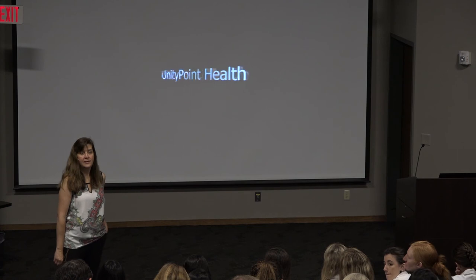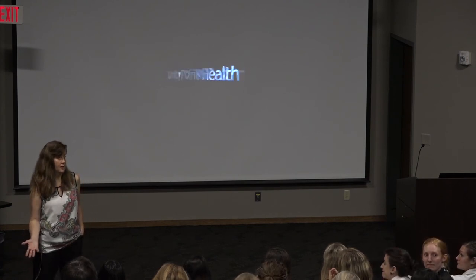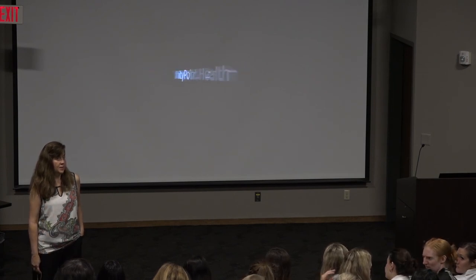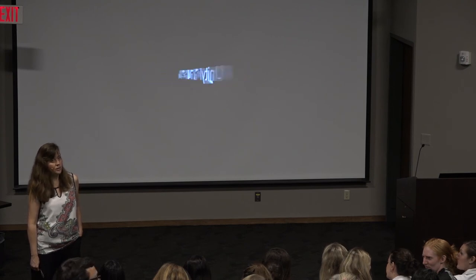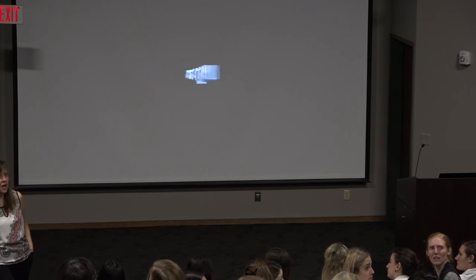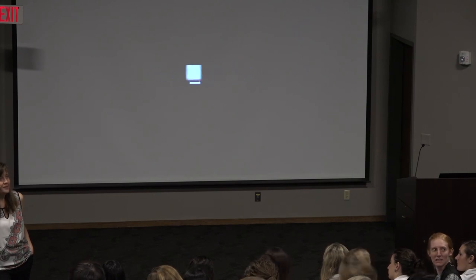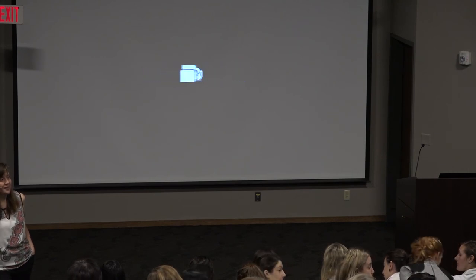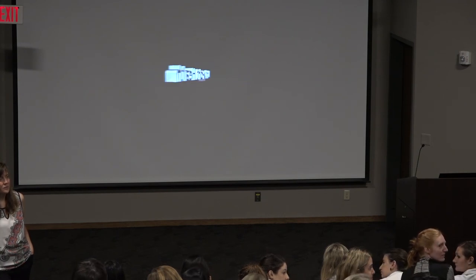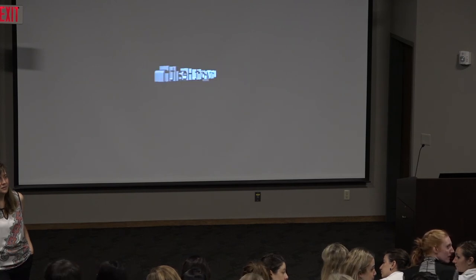So this would be a good candidate for an MR to follow the ultrasound. If you're not sure, getting an MR to follow ultrasound for suspected AVM might be a way to help us clinically. It may be. I don't know. Has it been helpful? Honestly, we just started doing these, so I don't know. I think for the couple that we were concerned enough about, where we didn't want to just sit and wait, and the bleeding wouldn't allow us to wait, we had a couple women that got embolized because of that. So in that sense, I think it was helpful.